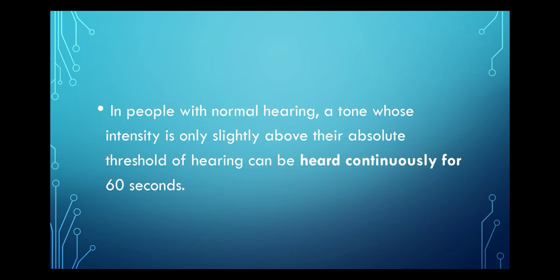In people with normal hearing, a tone whose intensity is only slightly above their absolute threshold of hearing can be heard continuously for 60 seconds. I repeat, with normal hearing, a tone above their absolute threshold of hearing can be heard for 60 seconds.